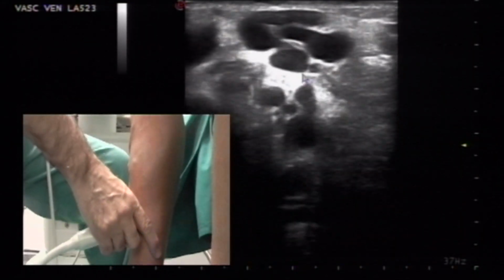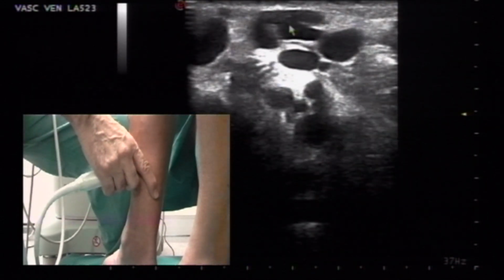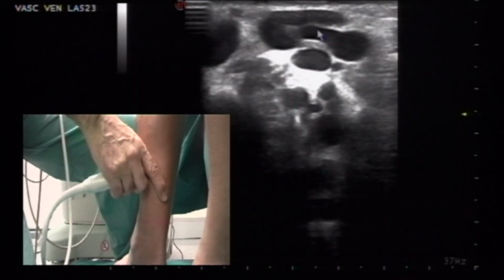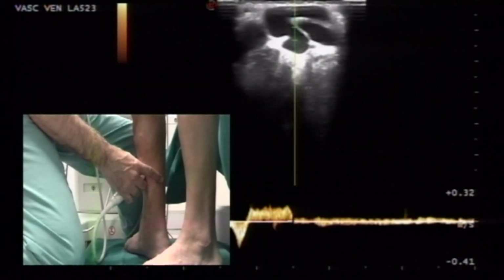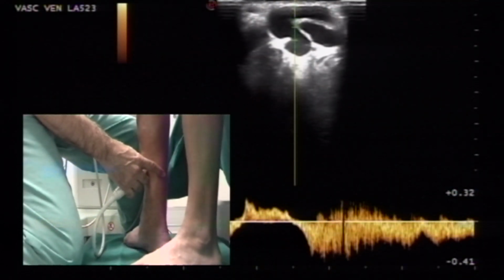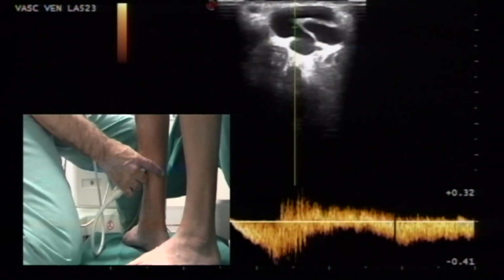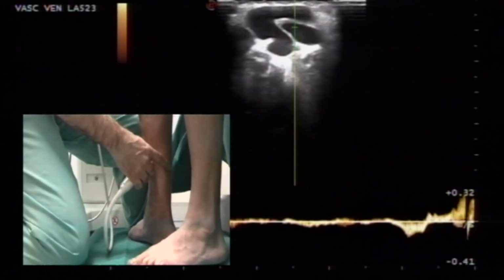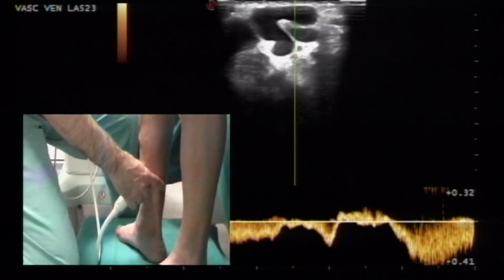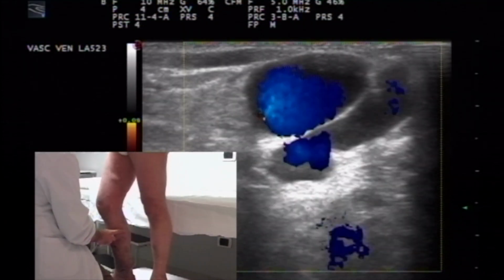Large diameter perforator in the lower third of the leg. Short systolic outflow but prevalent diastolic inward flow. It's a biphasic perforator that, despite the large diameter, is useful as a re-entry point. Direct competent perforator vein of the calf.